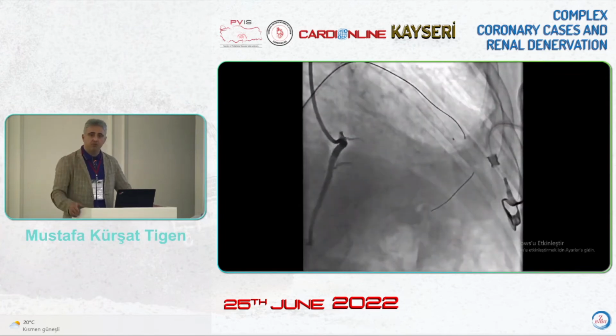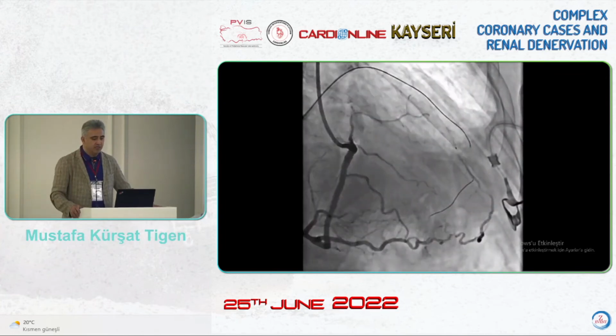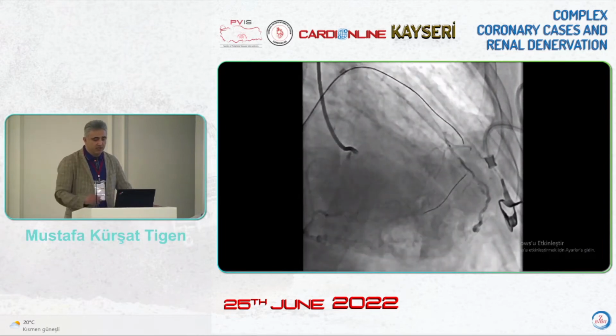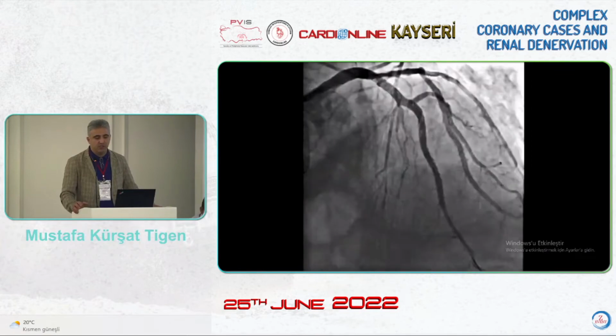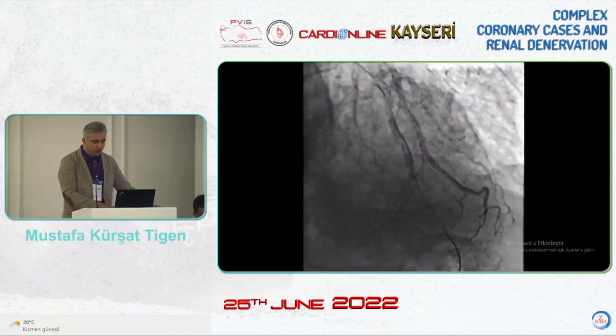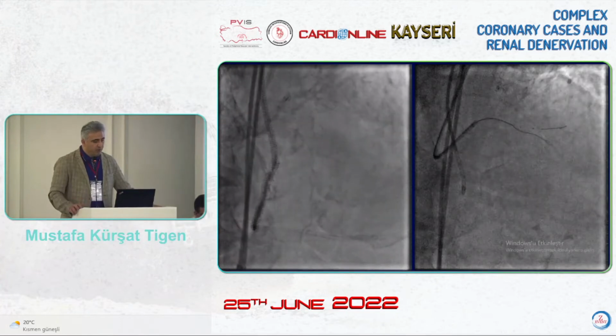You can have a better penetration capability wire. You see from the distal we are in the side branch, and after stent implantation, we have a very good imaging.